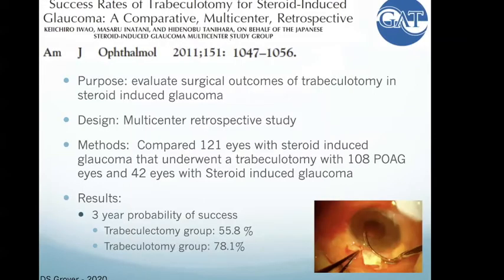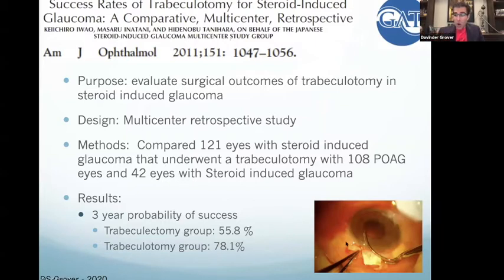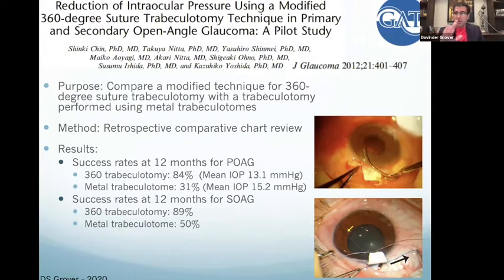This is a study that showed steroid-induced glaucoma, showing that even just a Harms trabeculotome, just opening up a little bit of the angle, is more successful than the trabeculectomy group. So steroid-induced glaucoma, I think this is even better than trabeculectomies. Not equivalent. In this study, there's the question of how much of the angle you have to open up. And when you compare the Harms trabeculotome to a circumferential trabeculotomy, it's showing that the more of the angle you open up, the better results you get. So I think it is important to open up at least 180, if not 360 degrees.